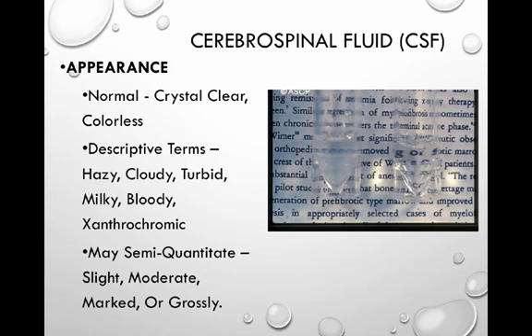The picture shown here is putting print paper behind the CSF. And that's going to help you actually see clearly what the clarity of a specimen is. A cloudy sample is often an indication that it contains white blood cells, and it would be seen in meningitis.